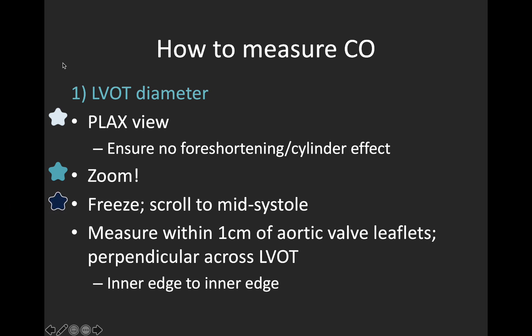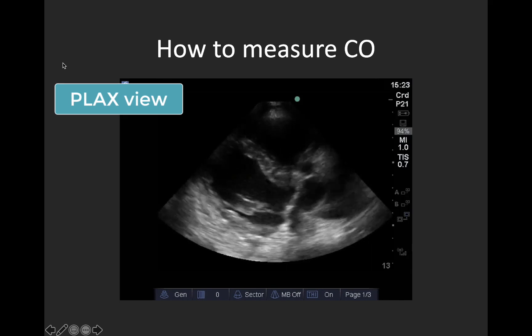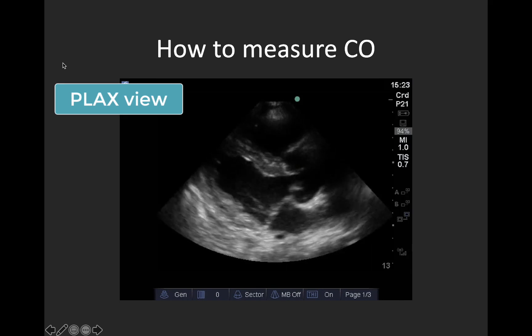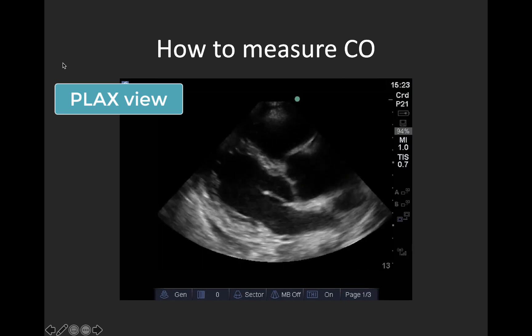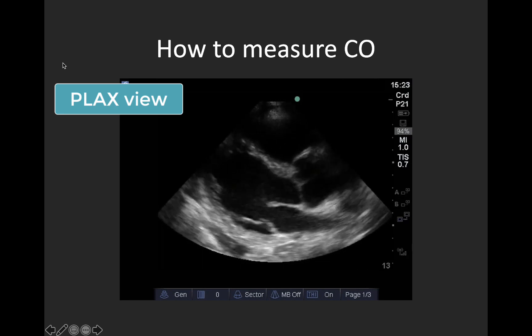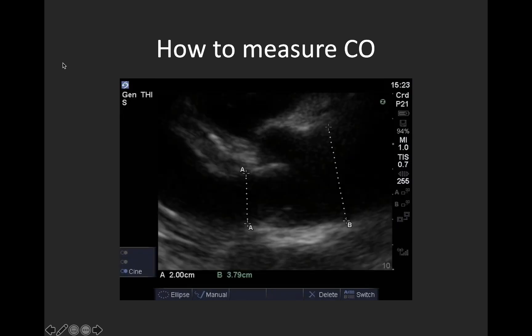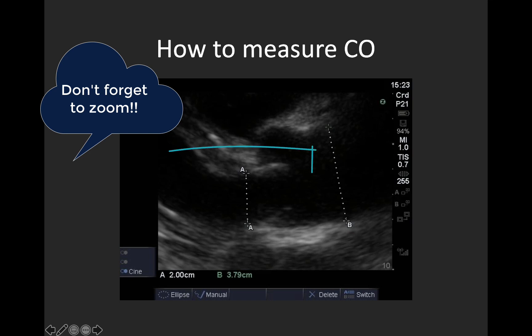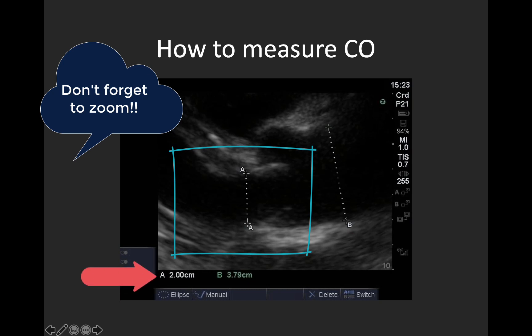We're going to zoom, then freeze our image and scroll to mid-systole, which will be represented by seeing the aortic valve leaflets fully open. Then we're going to use our calipers to measure inner edge to inner edge at the insertion point — or within one centimetre, guidelines vary — of the aortic valve leaflets. Here is an example of a nice parasternal long axis view used for this calculation. You need a good quality view without foreshortening and must clearly see the myocardium and valves. In the zoomed image with measurements, you can see we've measured perpendicularly across the LVOT at the insertion points of the aortic valves with the valves open in systole — our measurement here is two centimetres.